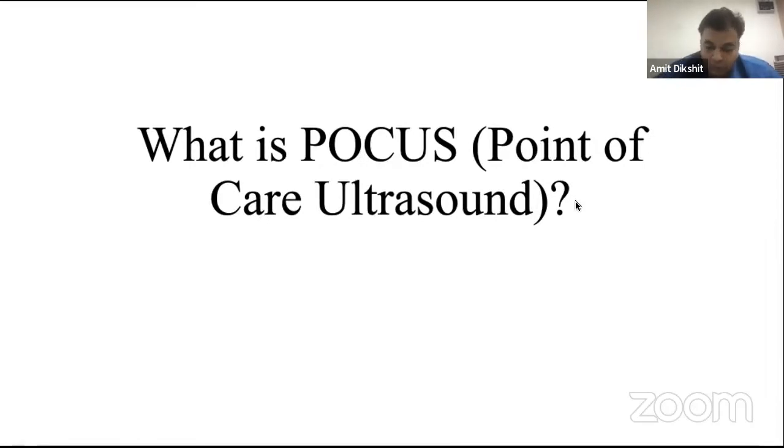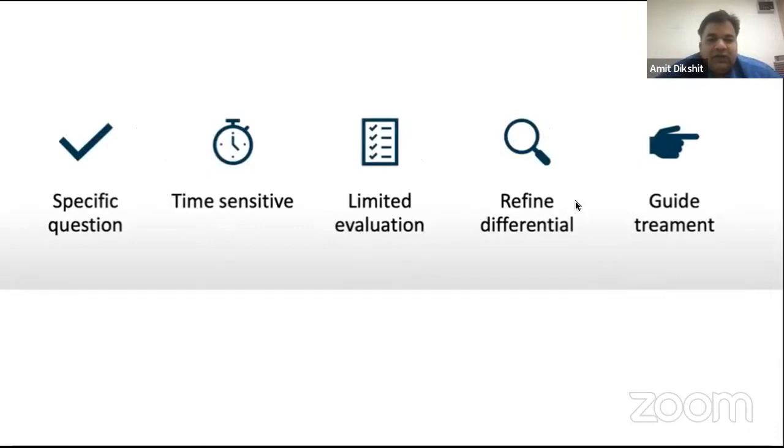So what is the point of care approach? And this is one everyone must understand. We are not assessing like a radiologist, just go and assess airway, nothing like that. We have a very specific question. And that is called the focus approach. Whenever the answer is binary in form of yes or no: is this patient a case of pneumothorax? Yes or no? Is it endobronchial intubation? Yes or no? Is this size of tube enough for this patient? Yes or no? Is intubation difficult? Yes or no? What is the tongue thickness? So all these are yes, no questions.